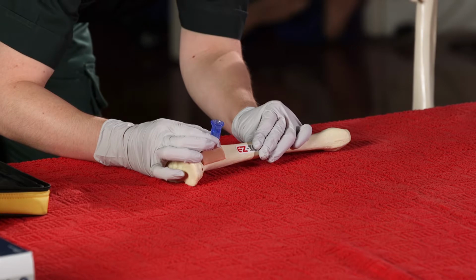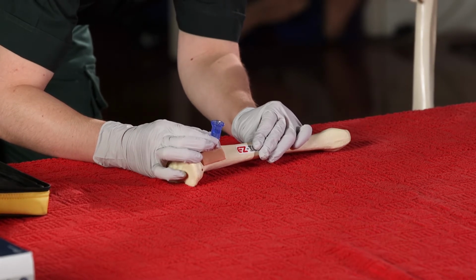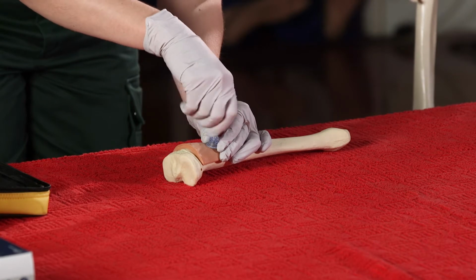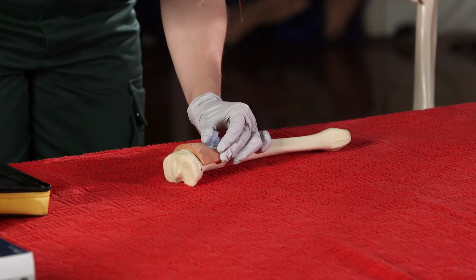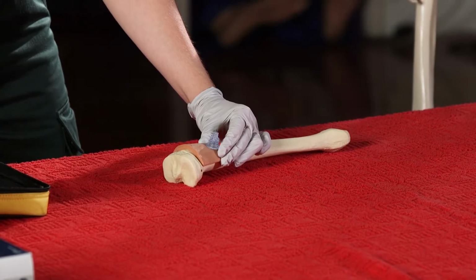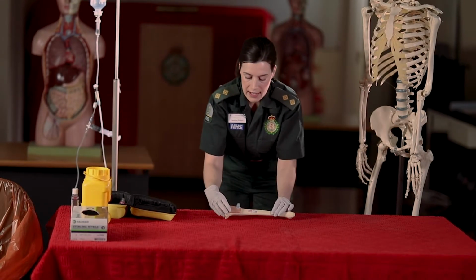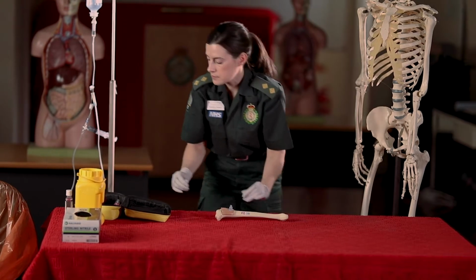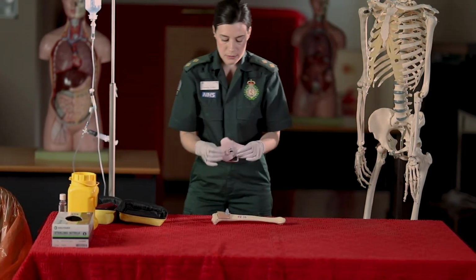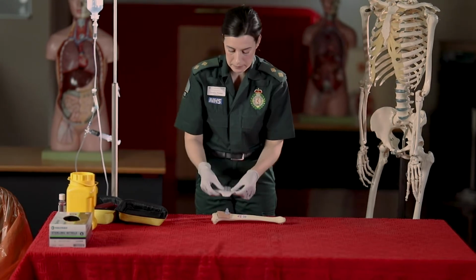Checking that that needle is firmly in place, I'm going to hold the bottom and unscrew the top, removing the needle, putting it straight into the sharps bin, leaving the catheter in sight. I'm then going to attach my dressing.